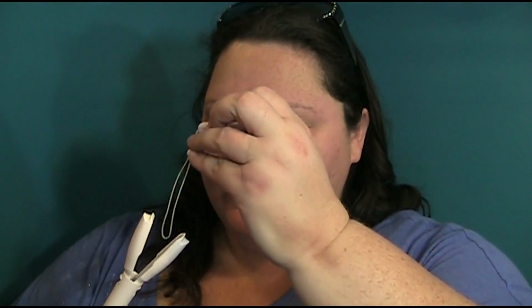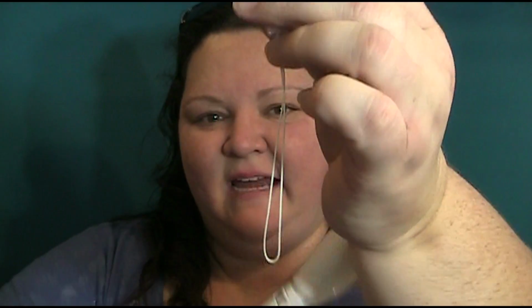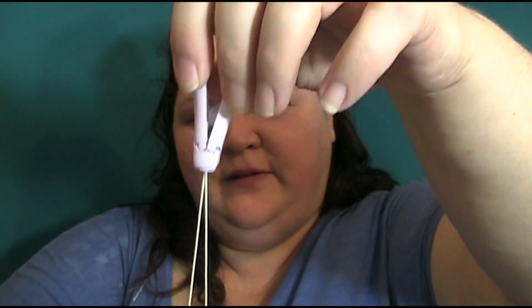And then you get the wand part. When you initially do it, it has this purple part in it. And you can see there's a little black thing in there. I don't know if you can see the hole where the strings go, I'm assuming. It goes down in there and this is spring loaded. It's got a spring in there that is attached to the strings, because that was one of my concerns when we were looking at the cervical cap. I swear in the picture it had strings, but as you pull on the string, the spring goes down. Okay.